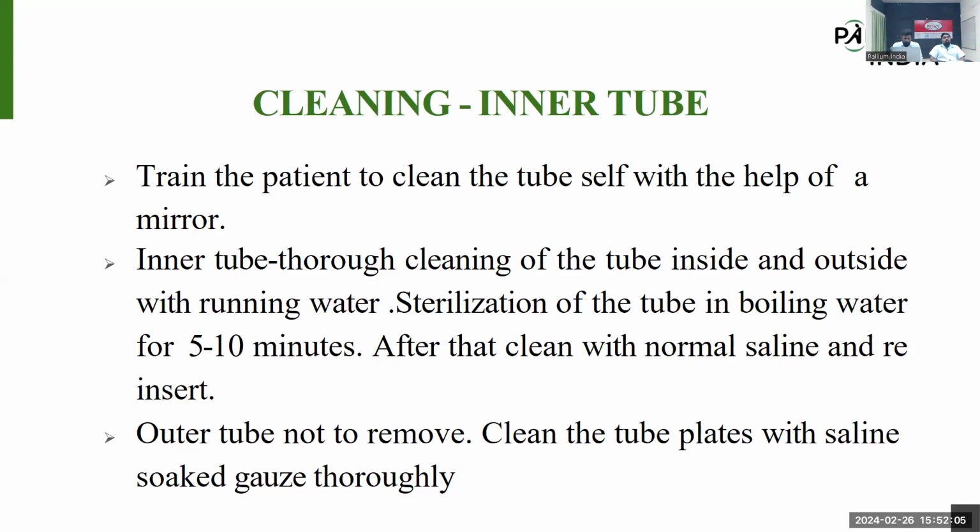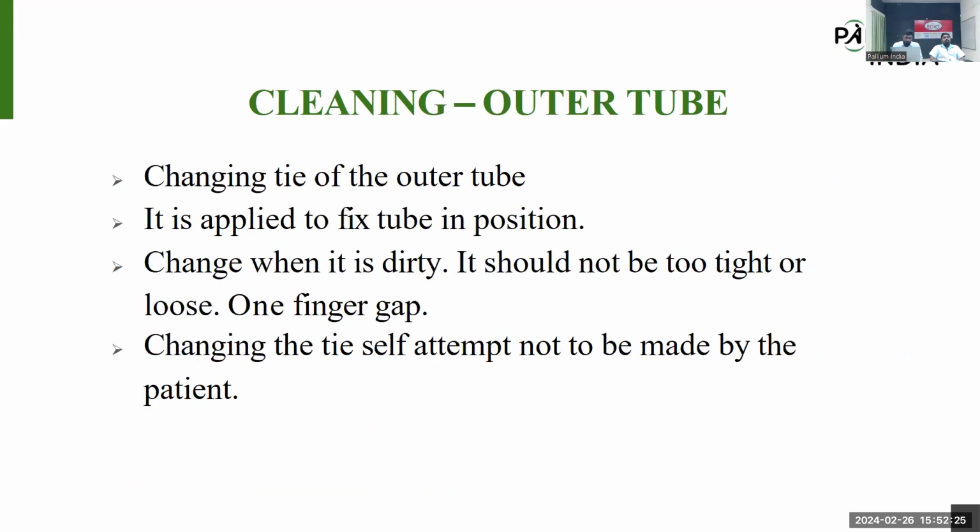Then the outer tube is not to be removed by the patient. The face plate or the two plates they can clean thoroughly with saline-soaked gauze. The tie also can't be changed by the patient; it can be done only with support. Next slide. So here, changing the tie of the outer tube is very important. It can be done only with support.